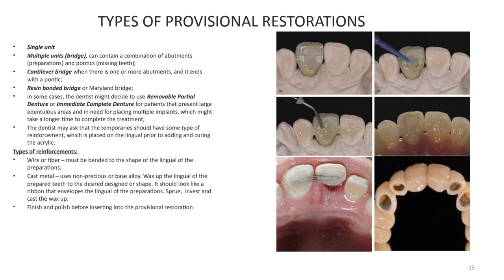So to allow for the healing and osseointegration process without any interference of producing force over the implant, and most important also, the patient to be allowed to maintain oral hygiene. Okay, it's very important the patient is educated how to clean during this time of healing and osseointegration process.